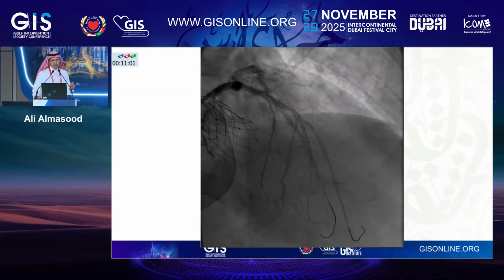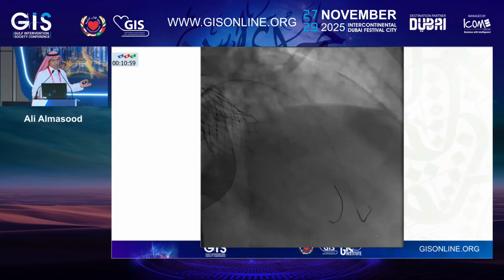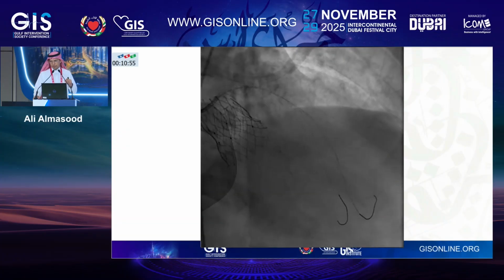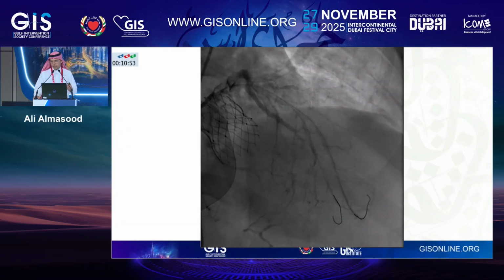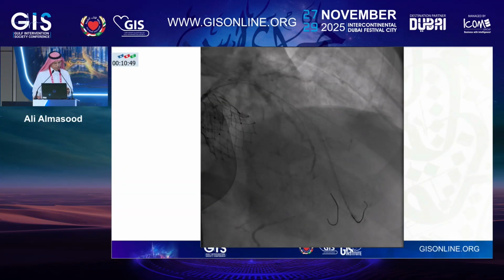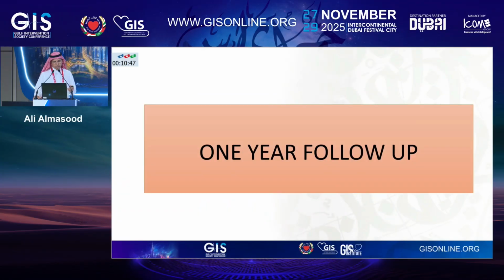You can see it's not very impressive. There are some dissections, the flow is not very optimal, but you need to hold your horses for these complex diffuse disease vessels, and you need to avoid the oculostenotic reflex. And we discharged him in good condition on maximum medical therapy, and he came back after 1 year.